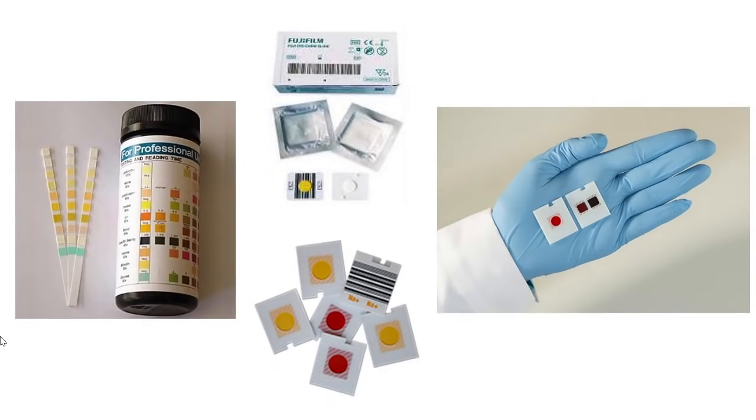Now, as you can see here in these images, basig matingala mo ma'am na ingon ani dipstick. This is actually an example of your dry reagent, or kanang dili exactly dry chemistry slide, but dry reagent. Wala pa man pud siguro mo, di ba nag urinalysis? So each of these pads is already incorporated with the reagents necessary to identify what needs to be identified. And di ba, dry.